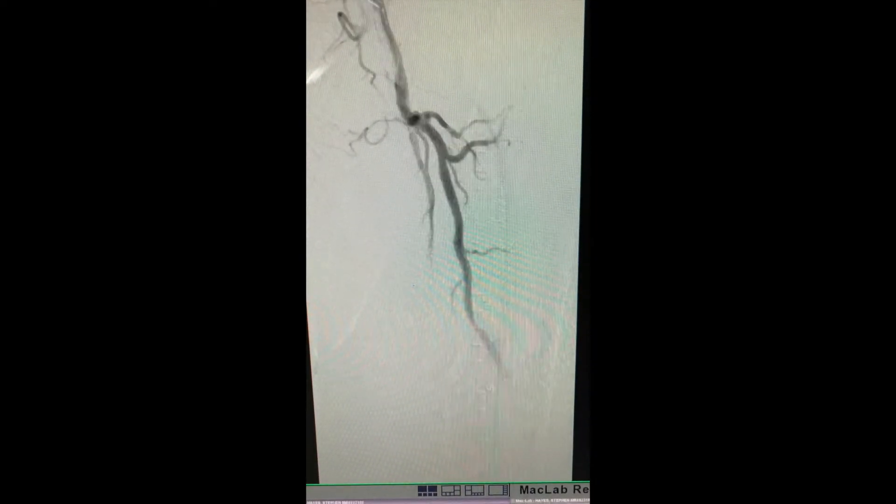I'll demonstrate a case. In this case, a patient who declined surgery for severe limiting left-sided claudication and left SFA occlusion — you can see the reconstitution at that point. We got sub-intimal in the distal SFA and advanced the Pioneer catheter to the re-entry point.